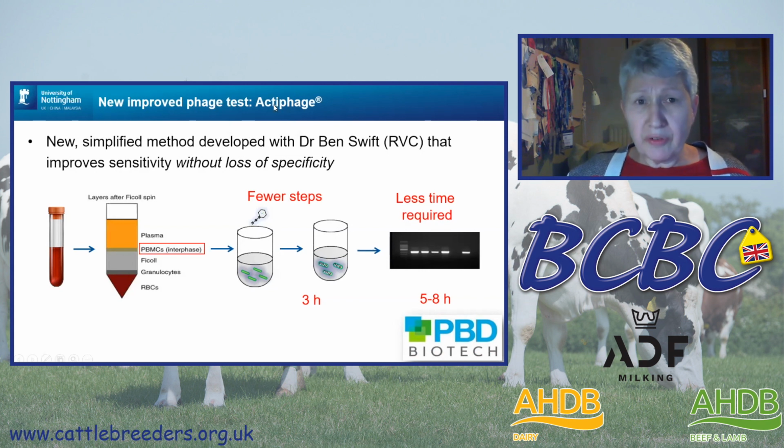Actiphage is a new, improved version that was developed in my lab along with Dr. Ben Swift, who's now at the Royal Vet College. The advantage of this method is that we got improved sensitivity without loss of specificity. The first stage of the assay is all the same: take the blood, purify the white blood cells. We then carry out the new modification assay, which is all done in a liquid phase, with no agar plates and no long incubations. We end up with purified DNA, which we can detect, again, using PCR-based methodology. There's nothing new about the PCR steps that we are using. They're the standard ones everyone uses.